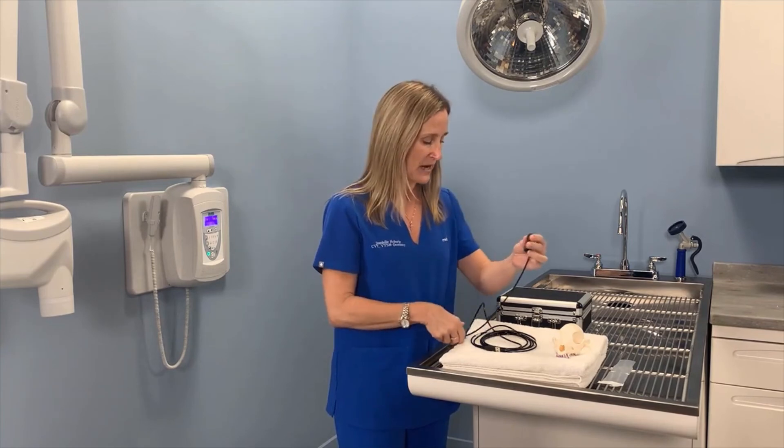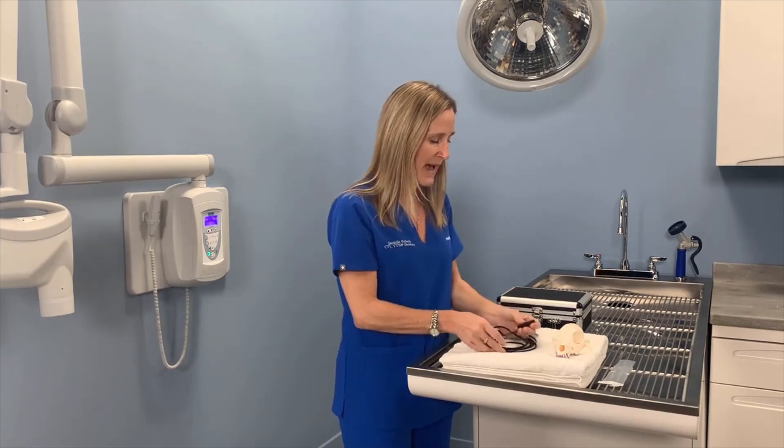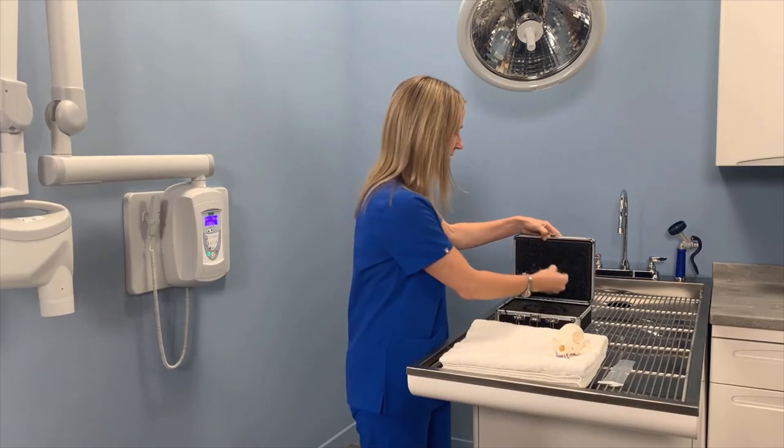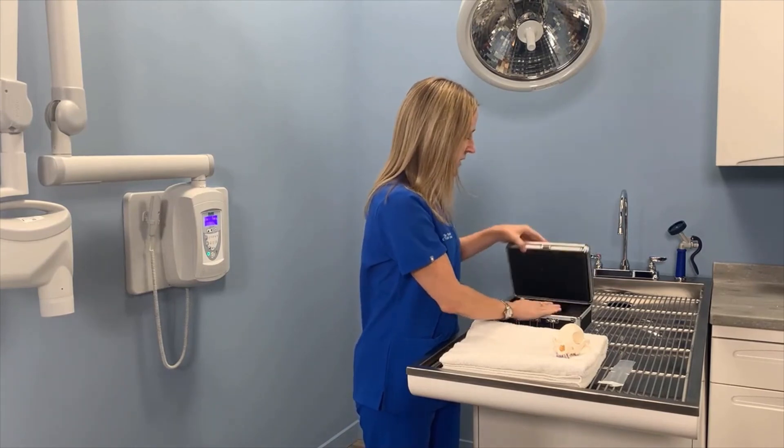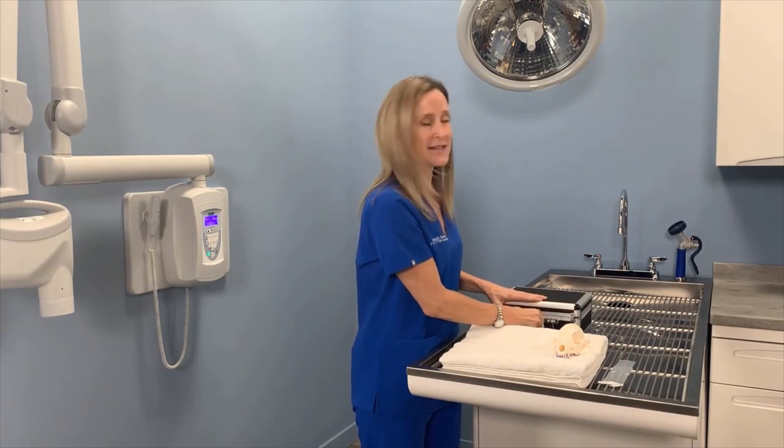When you're done doing dental x-rays for the day, you're going to coil this back up and place it back into the carrying case that it came in so that it stays safe.